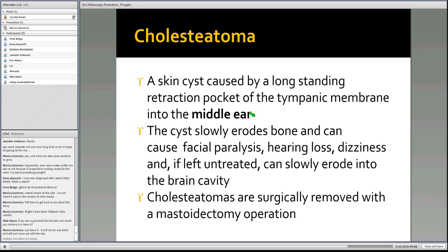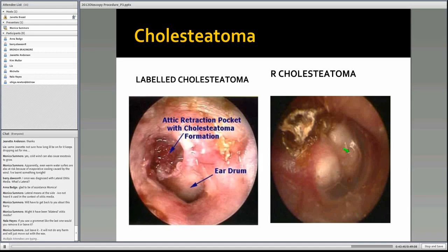They look... eardrum around it, but you can see these little bubbly growth things here. It just doesn't look pretty at all. And in this ear here, the growth is so big it's filling the middle ear cavity. Can you all see that white sort of tumourish growth there?